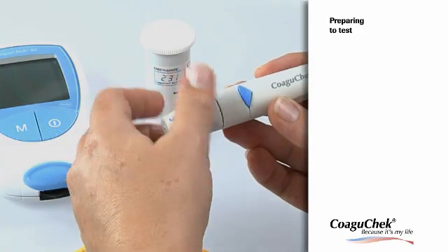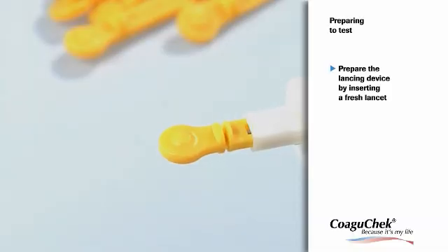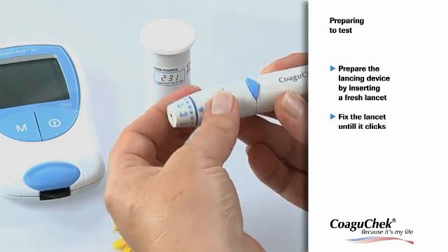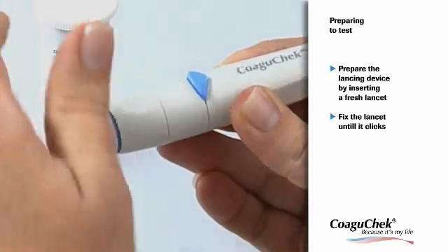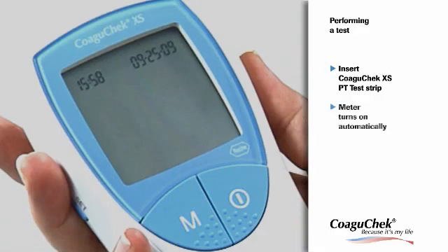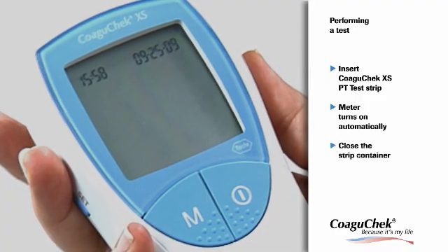Before you start testing, please wash your hands with soap and warm water and dry thoroughly. Now you are ready to prepare the lancing by inserting a fresh lancet into the lancing device. Fix the lancet and keep the device nearby. Place the meter on a level, vibration-free surface or hold it in your hand so it is roughly horizontal. Insert a test strip with the labeling facing upwards — the meter turns on automatically. Please remember to close the strip container again.